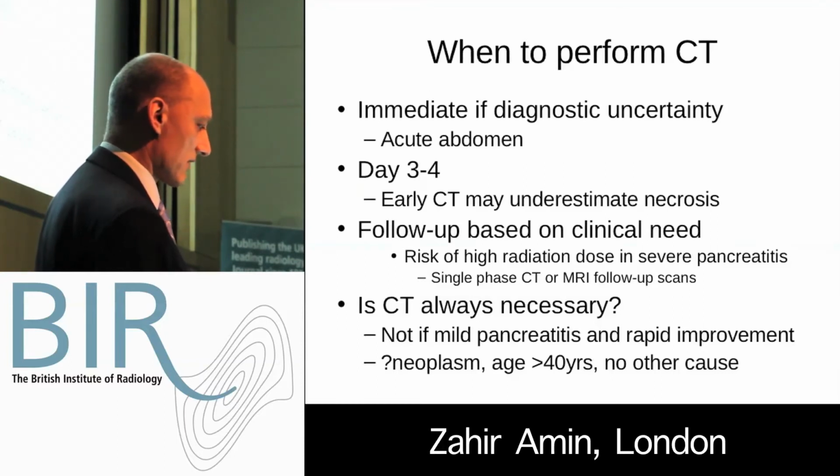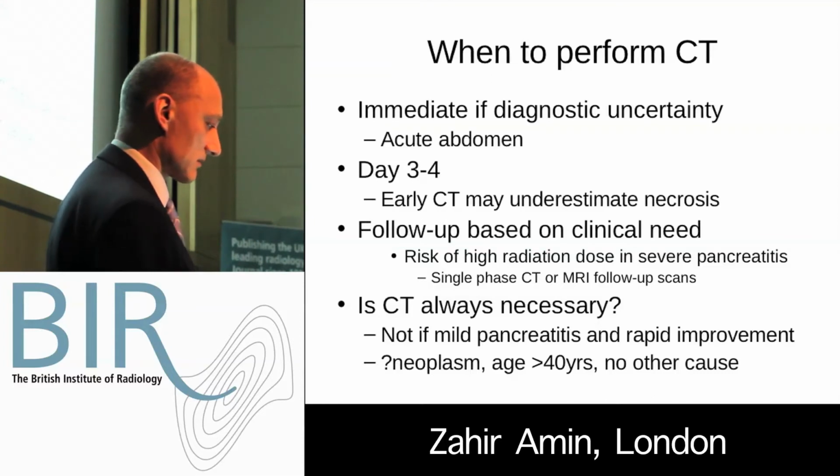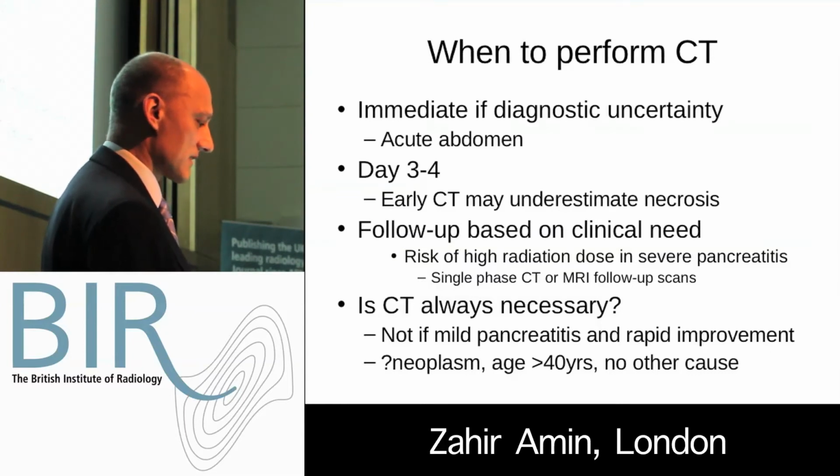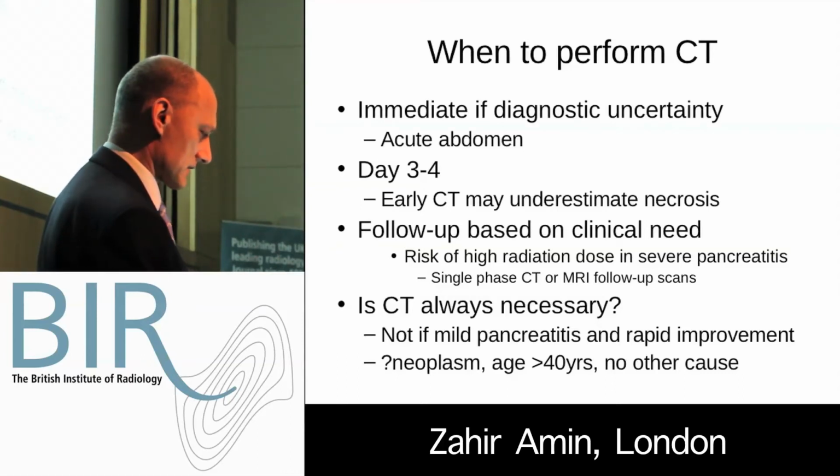There is a risk of high radiation dose in young patients with severe pancreatitis who can end up having very frequent CTs. And so for the follow-up, ideally you should perform a single-phase venous phase CT, or if the patient can tolerate an MR, an MR could also be used to follow up collections post-pancreatitis.